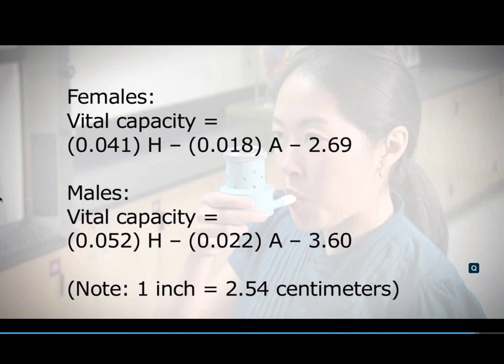Spirometry is a clinically significant tool. For example, spirometry could reveal a restrictive disorder such as tuberculosis if measured vital capacity is much lower than expected. Predict your vital capacity using the appropriate equation. As you head into the lab, think about the measurements you would expect from the spirometer and why vital capacity changes with age and exercise.